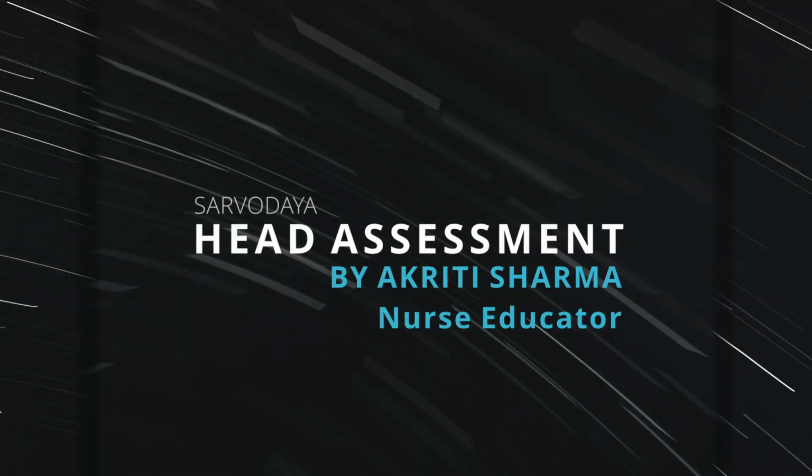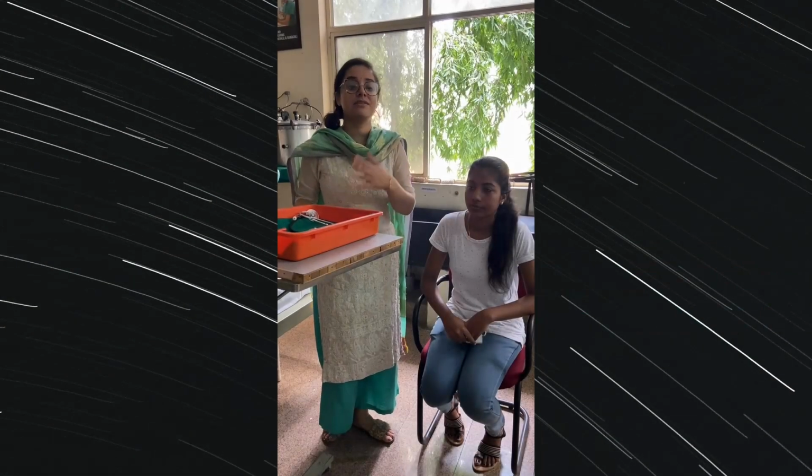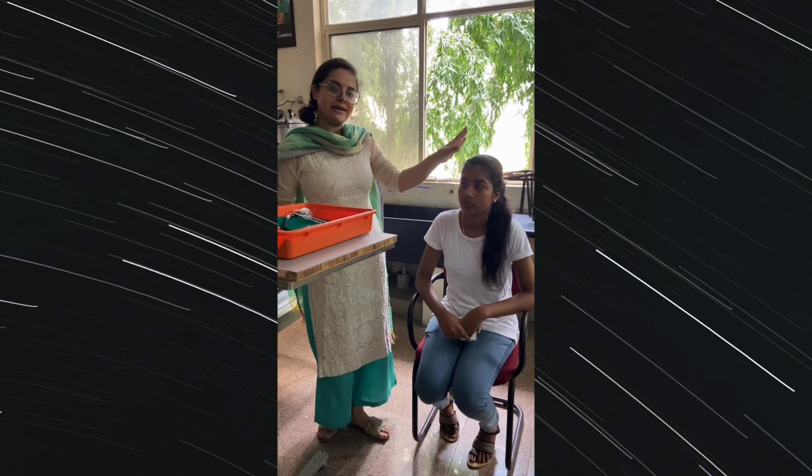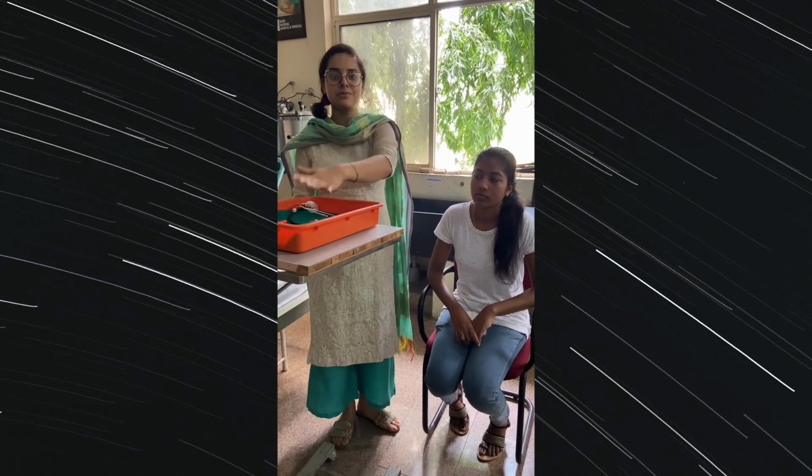Everyone, today we are here to have a little discussion about our systemic examination of the full body. We are going to start from the head, and before we assess the head, we want to have a look at the instruments. Can you show here?